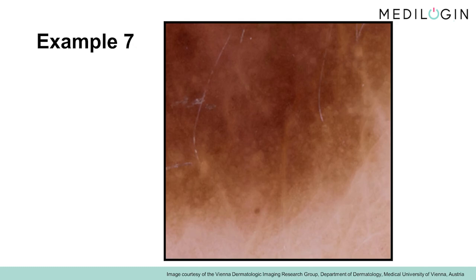Let us now switch to the basic pattern of circles. Here you can see an example of an image where the circles are relatively difficult to recognize, because the color difference is not very strong. The circles have a dark pigmented edge on the outside, and are clearly lighter on the inside. In this section, they form the basic structure of the nevus.